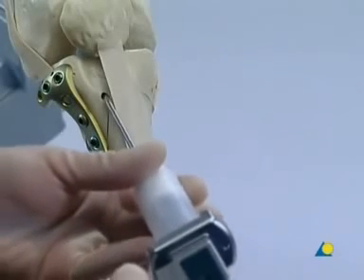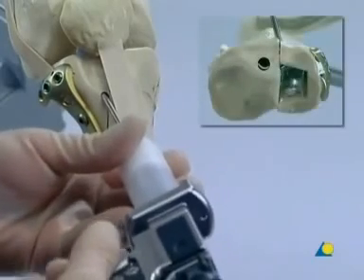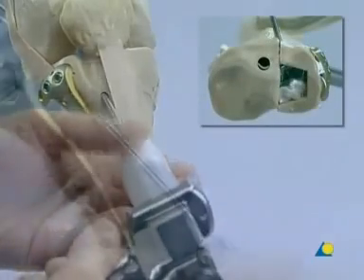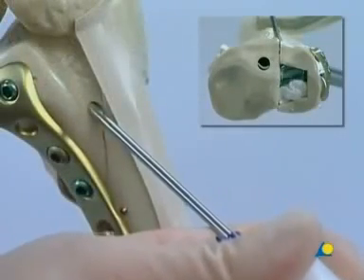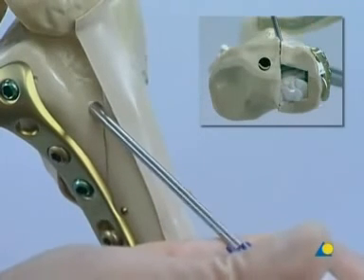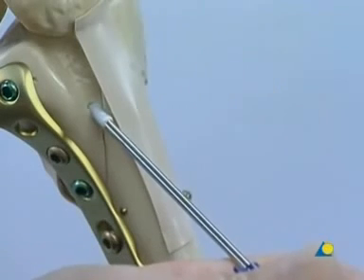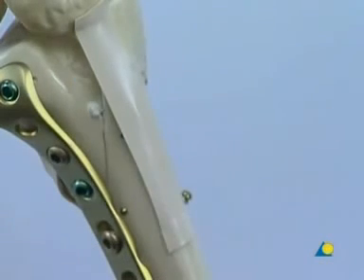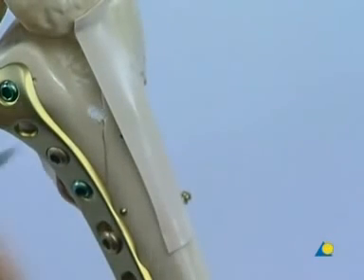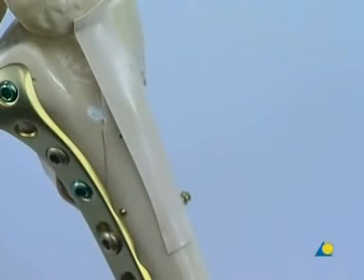The cannula is inserted into the defect, and the defect is filled by squeezing the trigger slowly and steadily. Excessive pressure is avoided. Finally, excess Chronos inject material is removed from the bone surface.